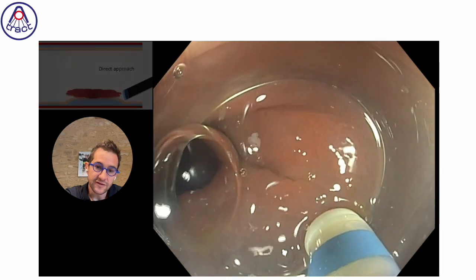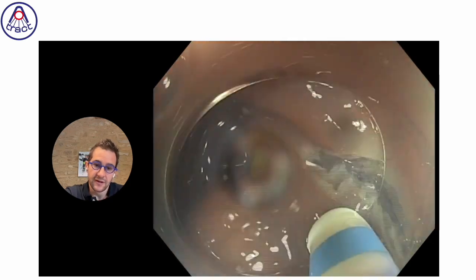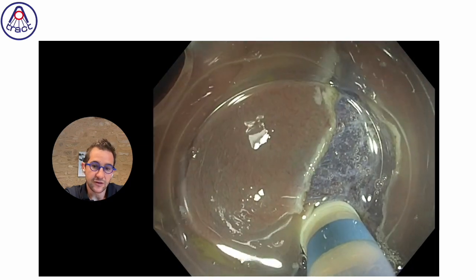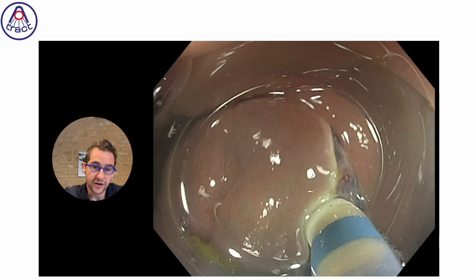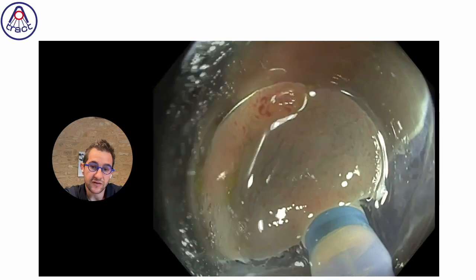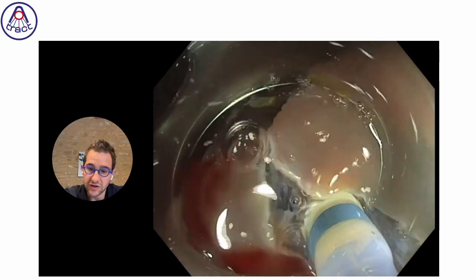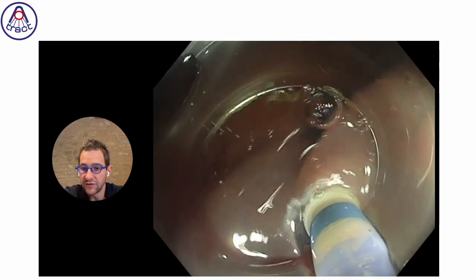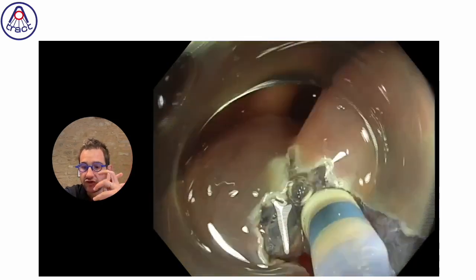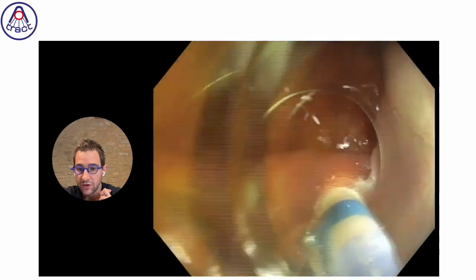So once you do it, you try to reach the opposite side of the incision. And once it is complete, you do your trimming once again at the anal edge in order to increase the space to set up the traction device and to make it easier to catch the edge of the lesion without catching the muscle. So the strategy is relatively simple and always the same. Try to open the space in order to be able to fix the traction device on the edge without catching the muscle or the opposite edge.